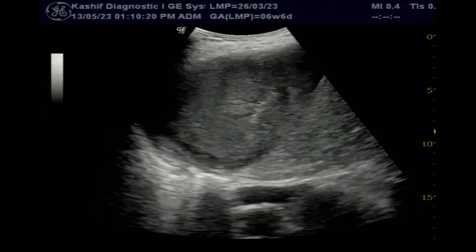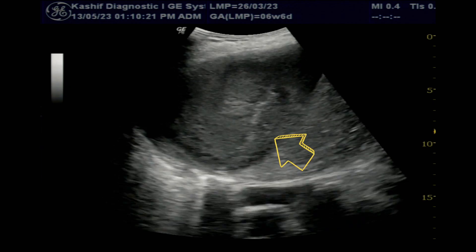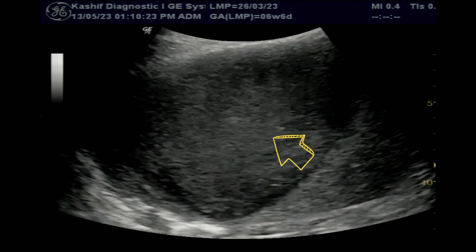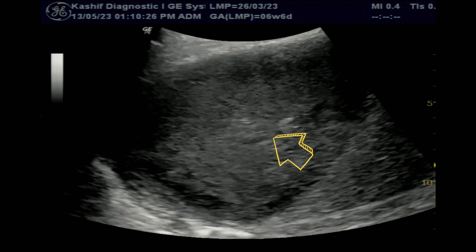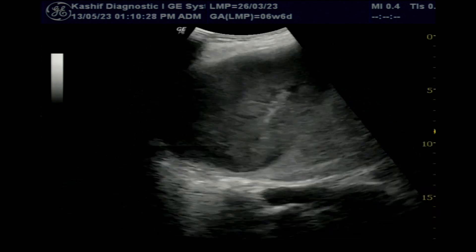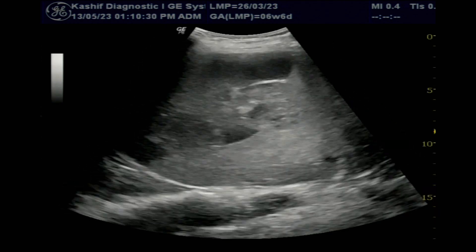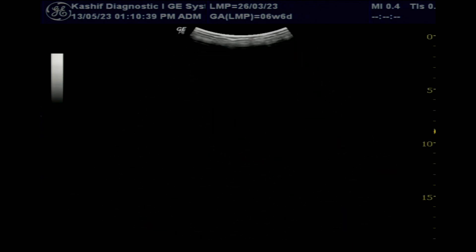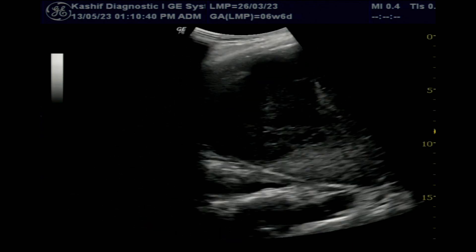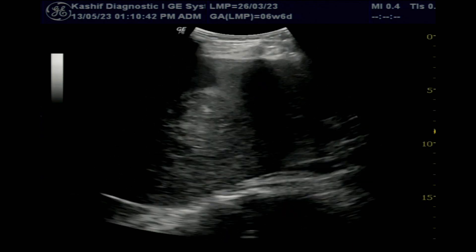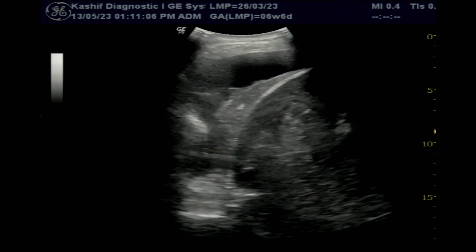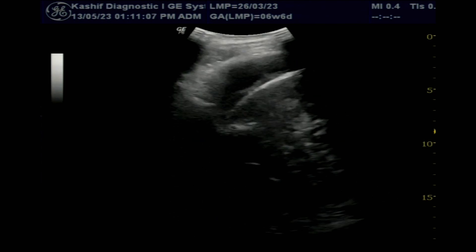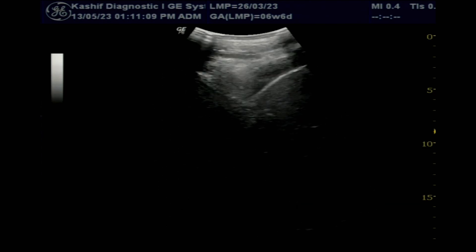Note the movement of fluid with patient respiration and probe pressure. This is a case of amoebic liver abscess caused by eating contaminated food and water. Every year the parasite causes up to 40 million infections and up to 100,000 deaths.